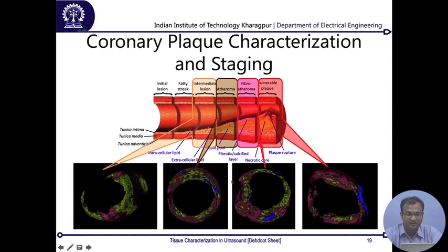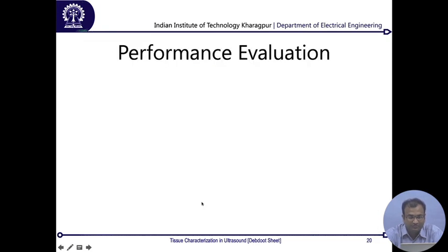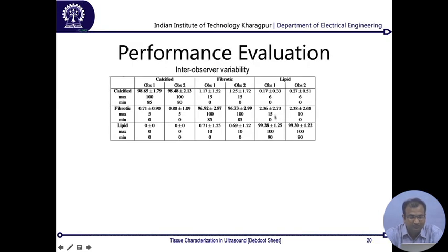But obviously if you try to learn with this sample without any necrotic example, then your model will not have any necrotic learning ability as such. So that's one thing which you need to keep in mind as to how to choose perfect examples for learning. Now from there I come to this performance evaluation.